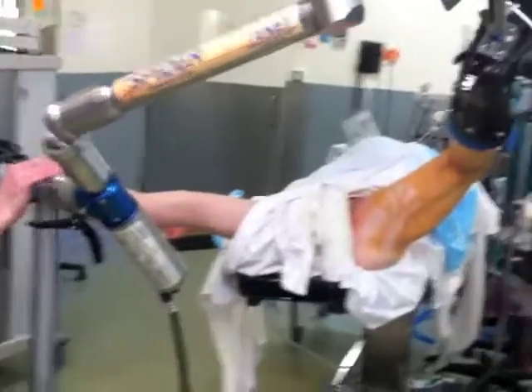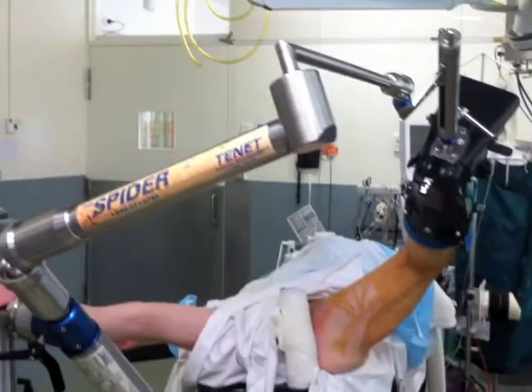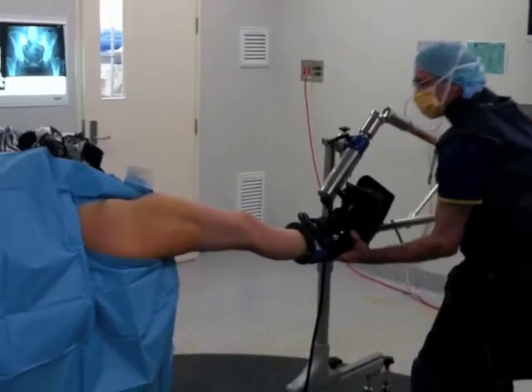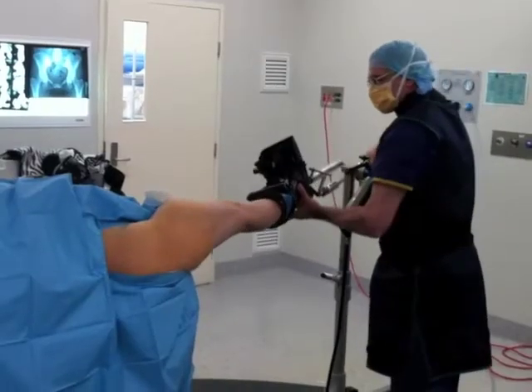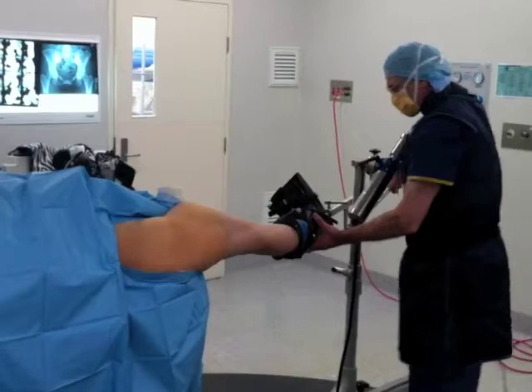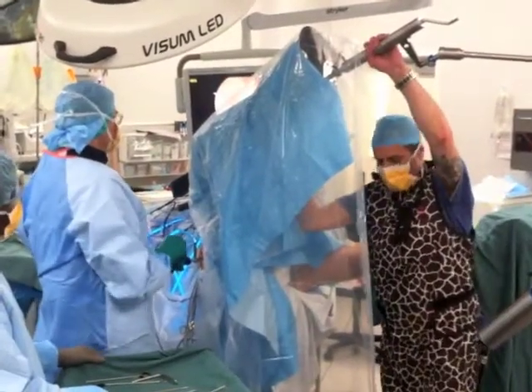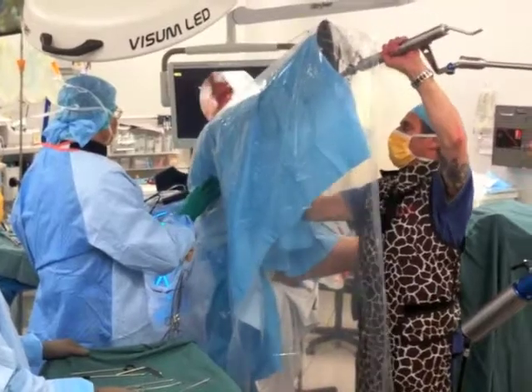Using this unrestricted device, the hip can move easily into any required position in space without the need to disengage the boot or the foot from the traction arm. Getting in and out of traction into any required position is easy and fast.